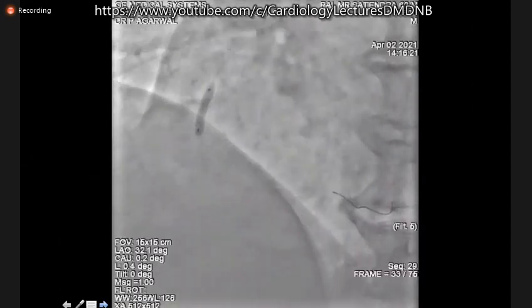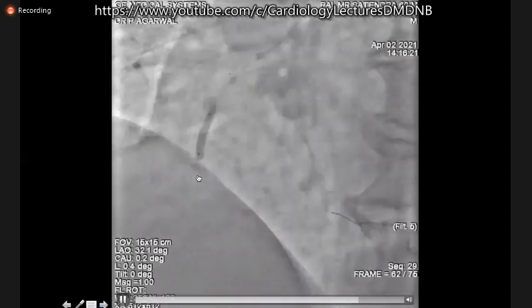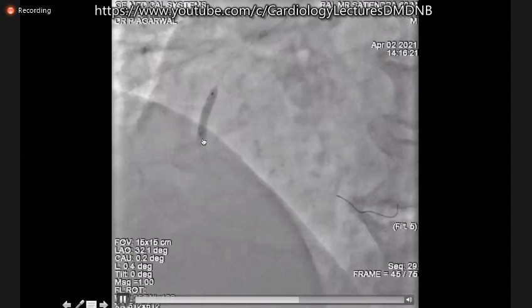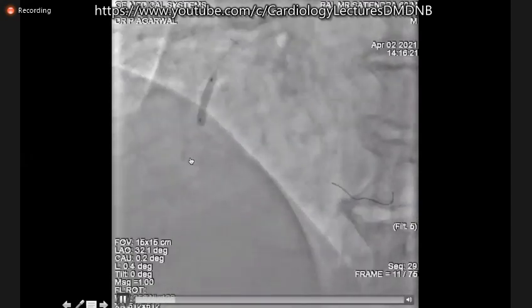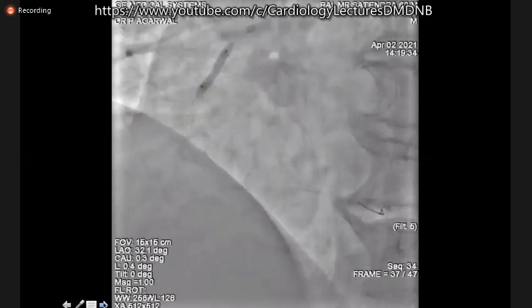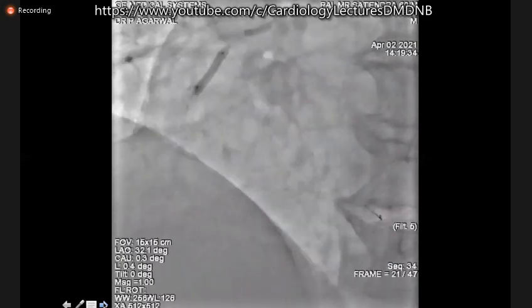So we went ahead with that balloon. And you can see, we are quite ahead, about 7.25 mm ahead of that, so that we are not missing any parts of the scaffold not being dilated. Right, again, proximally also you're doing a good job. And the pressure is about, say, 23, 25 atmospheres.